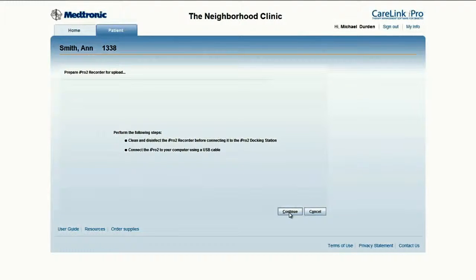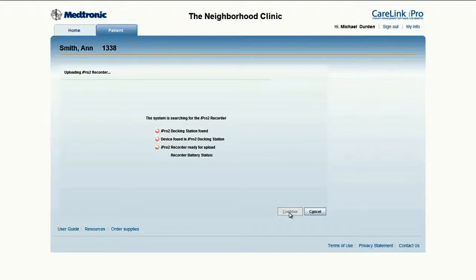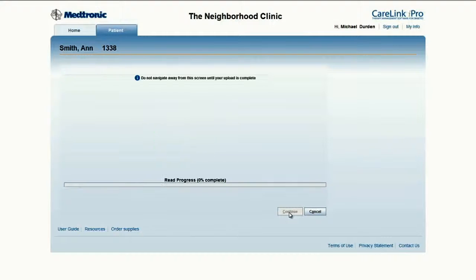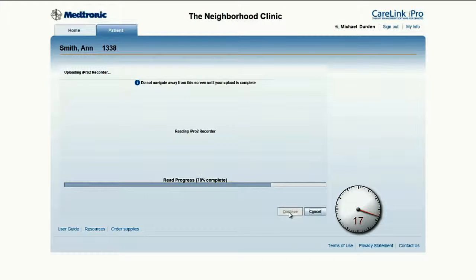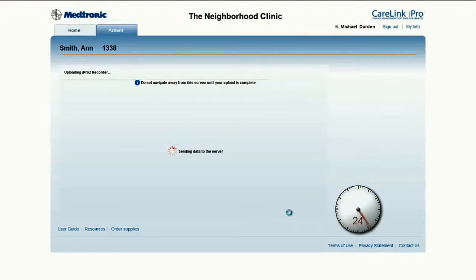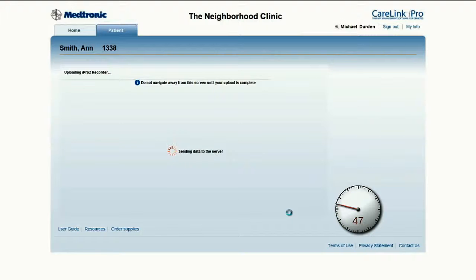Click Continue. This begins the communication between the software and the all-in-one smart dock. It does a quick check to make sure all the devices are connected, as well as testing the battery. The software now automatically continues to the next screen and begins to pull the data from the recorder. A clock has been added to show how quick this upload process is. Once the data is pulled, it is sent to the CareLink iPro server and checked for quality. This database utilizes state-of-the-art security measures, including a three-tier firewall.